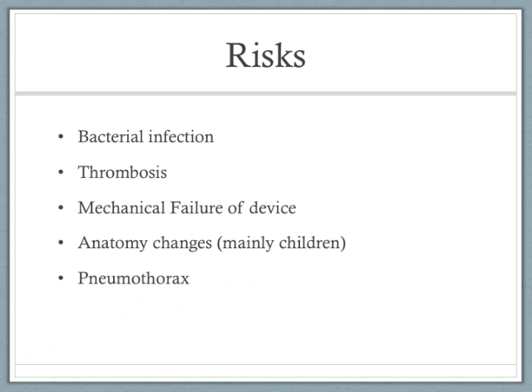Another problem can be thrombuses. A thrombus can prevent flow through the device. It can be prevented by flushing with saline or heparin as prescribed by the physician on a regularly scheduled basis. If there does end up being something blocking it, this can be corrected in the hospital setting using clot-busting medications, but in the pre-hospital setting you're not able to correct it at all.